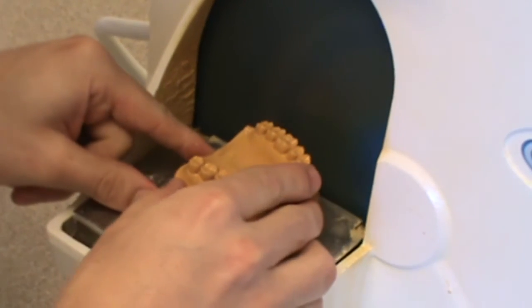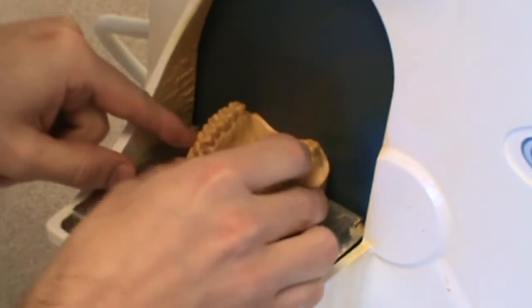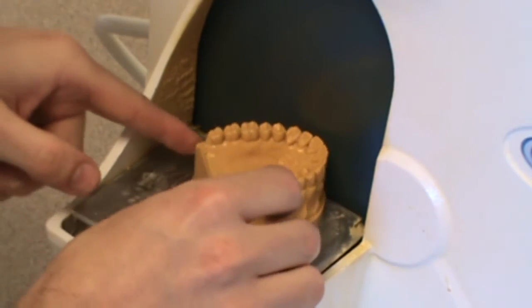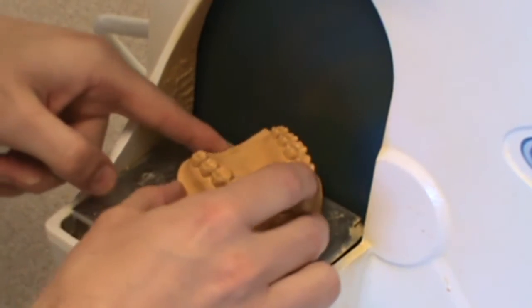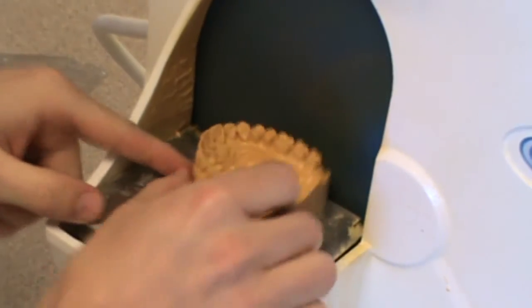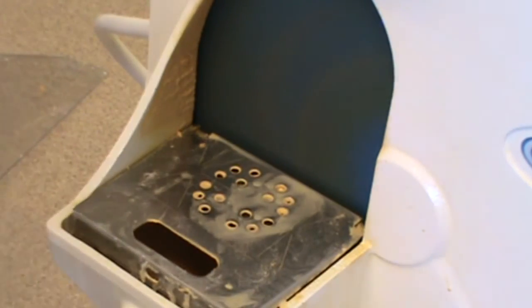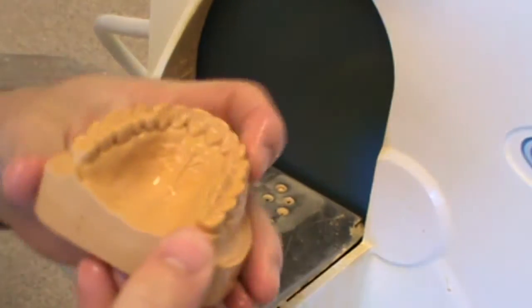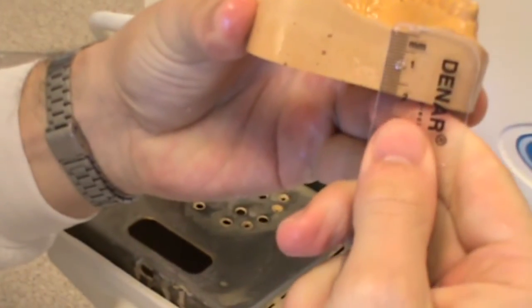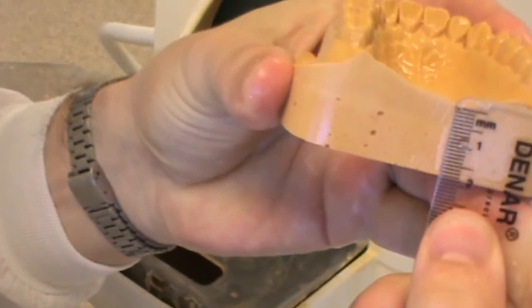I'm trimming to where I can see the plastic demarcated line around the borders of the cast. As you're trimming close to the anterior teeth, you need to be careful that you do not hit them. You need to really focus in that anterior area because those teeth flare anteriorly, and it's very easy to accidentally trim those anterior teeth.